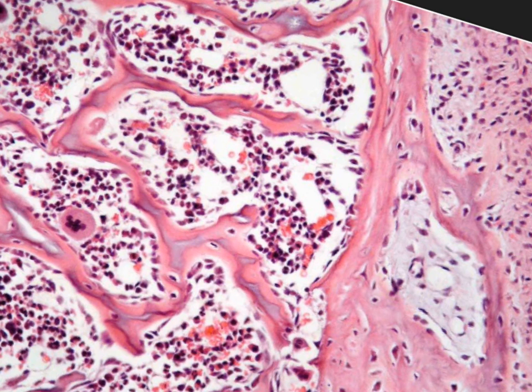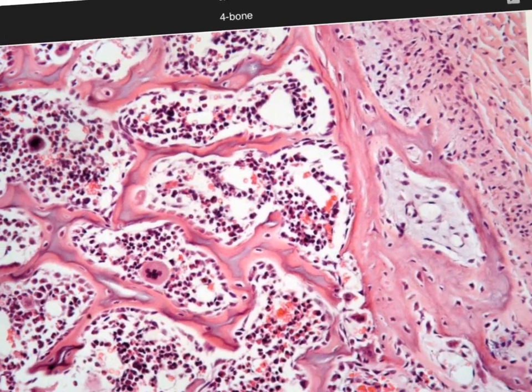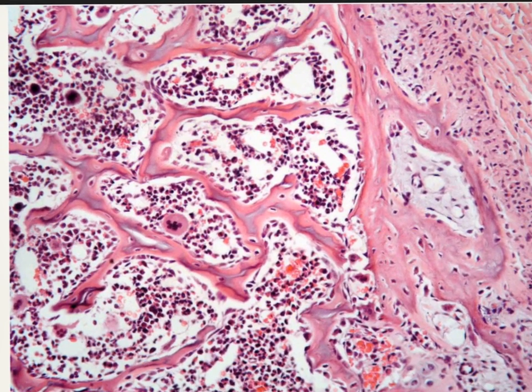This is a very nice picture for the spongy bone. Here in the spongy bone, we have the bony trabeculae. First of all, this is the picture with the original size. These are the bony trabeculae here, very evident. And in between we have irregular bone marrow cavities. In the bone marrow cavity, I can diagnose this large cell with single multi-lobed nucleus. It is the megakaryocyte. And we have the different hemopoietic cells.